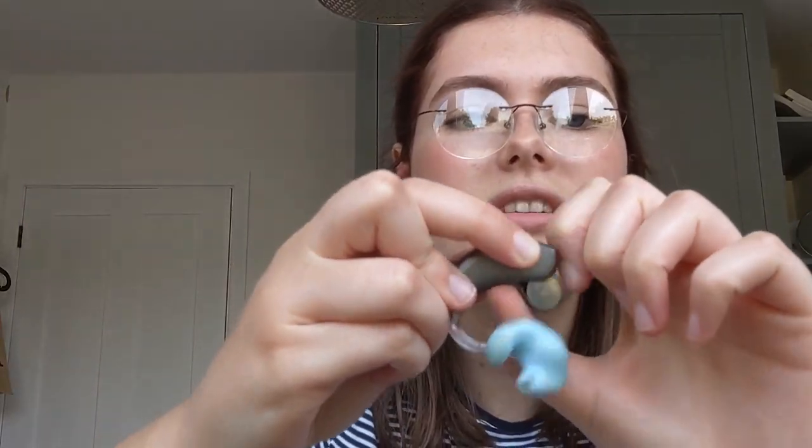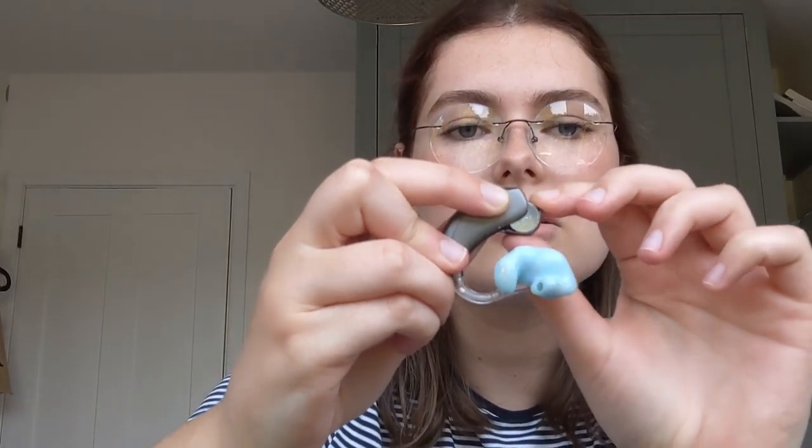There's a little door for the battery compartment - you just open it and there's a battery in there. These are the high-powered ones so they take larger batteries. They take size 675, which I think is the largest type of battery - so this is worst case scenario. If you've got a bit more hearing you might be able to get really small rechargeable ones with just a little wire and not have to worry about batteries at all.